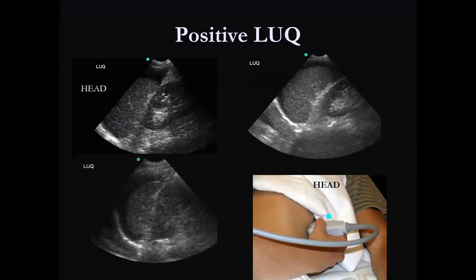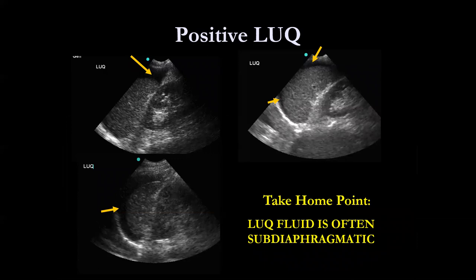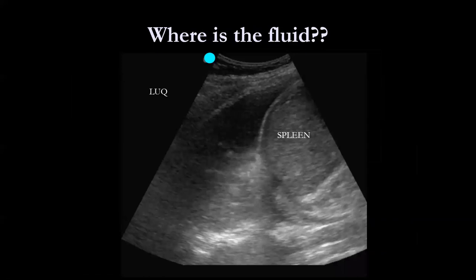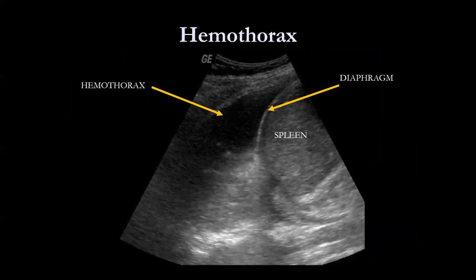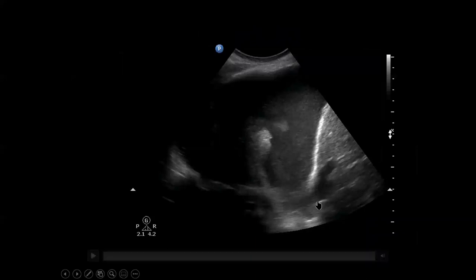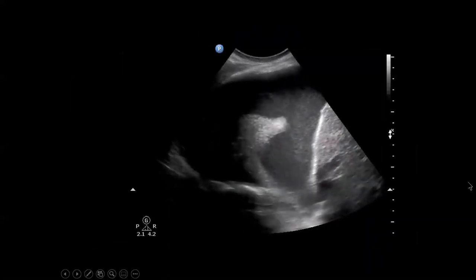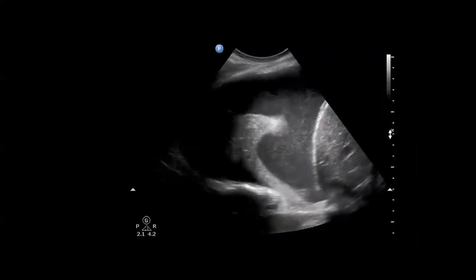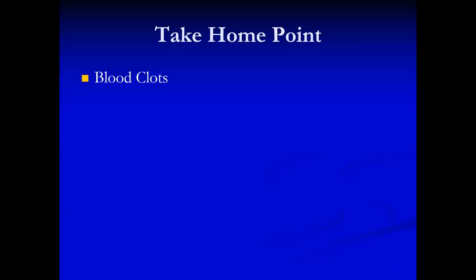For a positive left upper quadrant view, notice that the free fluid is actually above the spleen in the subdiaphragmatic space — this is not uncommon and will often be the first place you see free fluid. You can see the bright white stripe of the diaphragm, and above it is the fluid — that's a nice hemothorax. Here's another example of a hemothorax where you can actually see aerated lung flapping around in the hemothorax. Also notice that the fluid is not anechoic — some of it has layered out. Keep in mind that blood clots. If you're getting a trauma patient transferred a few hours out, don't be surprised if the blood has become echogenic as it starts to clot.